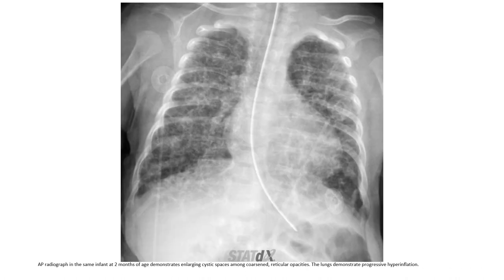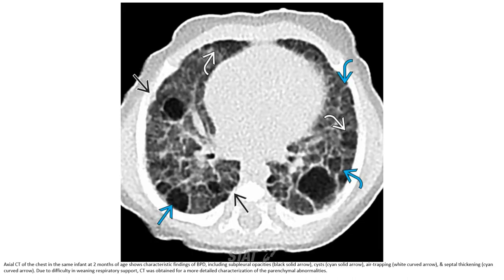Same patient at two months of age demonstrated enlarging cystic spaces, consolidation, reticular opacity, and the lung demonstrated progressive hyperinflation. Same patient CT at two months of age shows characteristic findings of bronchopulmonary dysplasia including subpleural opacity, cysts, air trapping, and septal thickening. Due to difficulty in weaning respiratory support, CT was obtained for more detailed characterization of parenchymal abnormality.